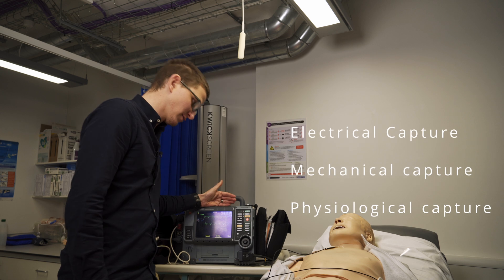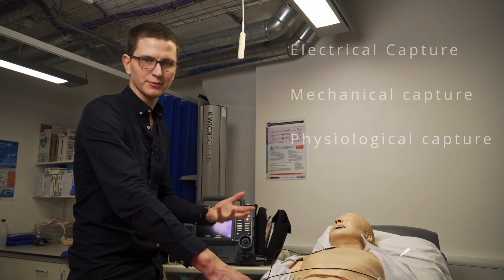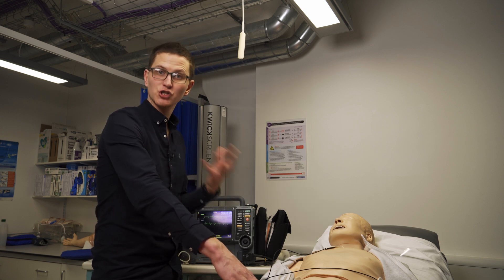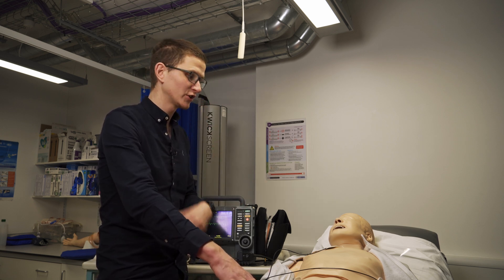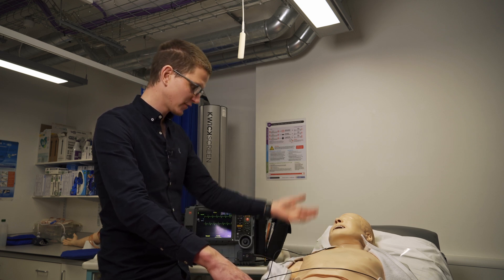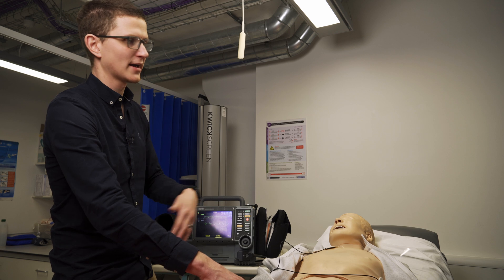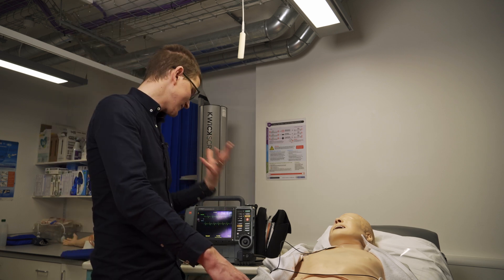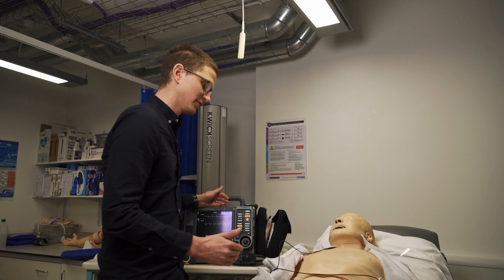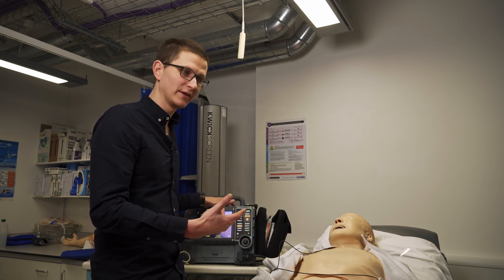Now that we have electrical and mechanical capture, we look for physiological capture — do we have a physiological response to this change in heart rate? We check blood pressure, level of consciousness, all these things. If the patient's blood pressure has now increased to, say, 100 over 70, we can successfully say we have electrical, mechanical, and physiological capture, and the patient is going to start waking up hopefully.